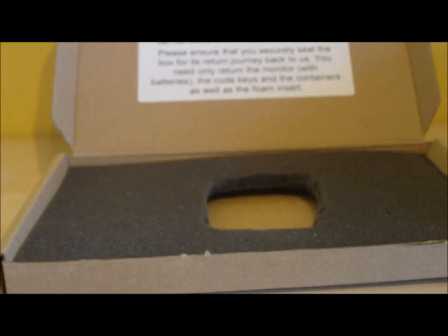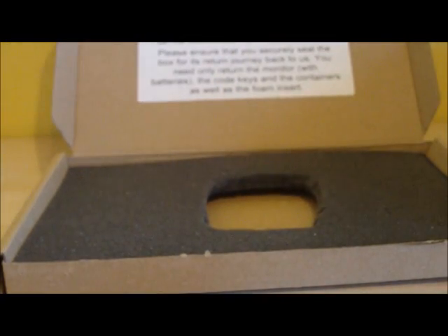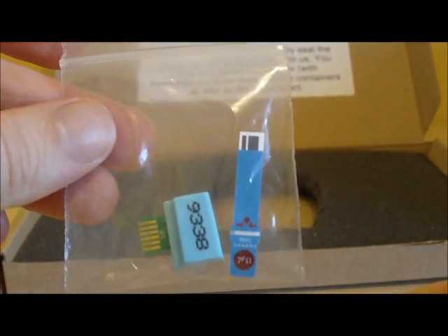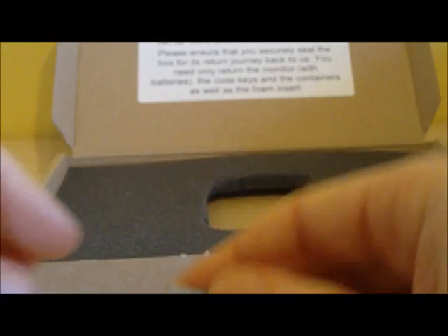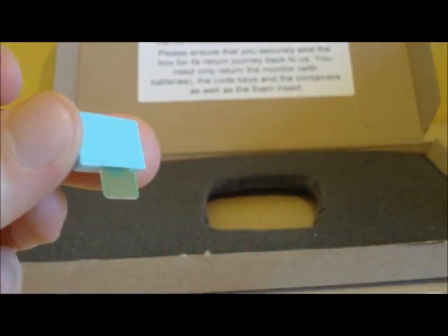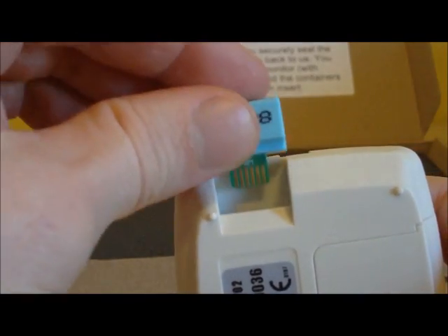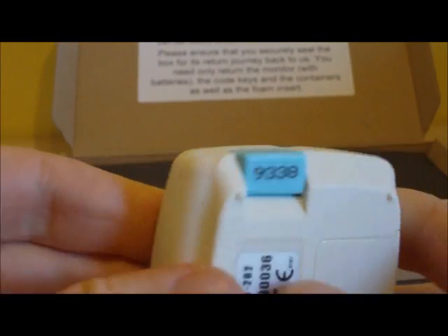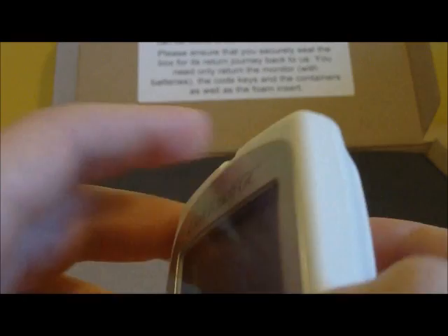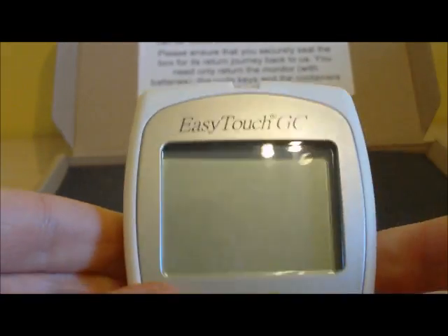So we are going to take our total cholesterol level. We are going to be using the monitor and we will need our blue test strip and blue code key. Take these out of the bag. We need to first insert the code key into the back of the monitor — on the top left hand side you will see a small slot. The code key fits in only one way and slots in quite easily, telling the monitor that you are measuring a cholesterol level and not a glucose level.